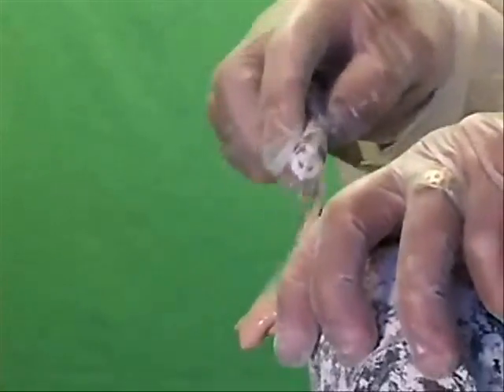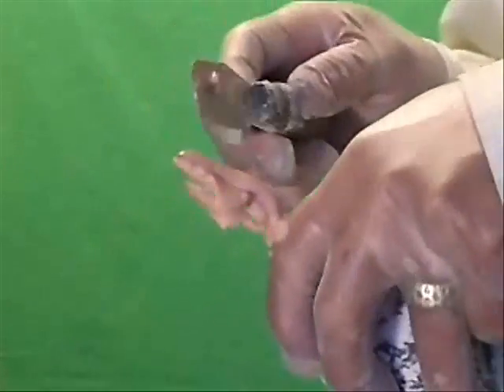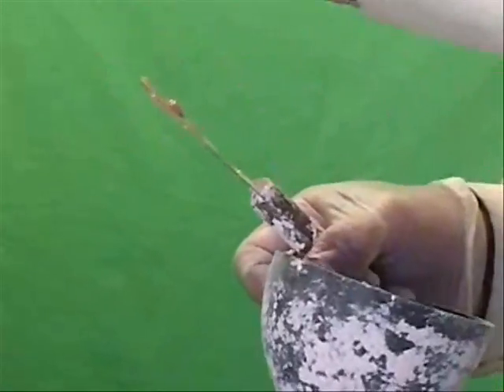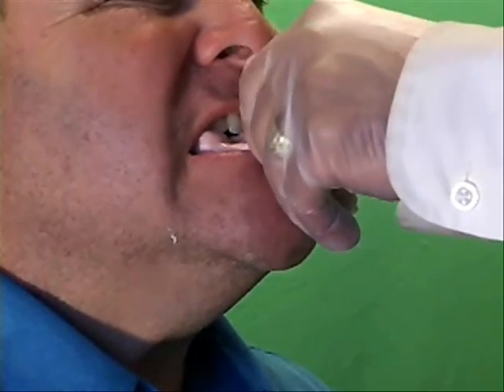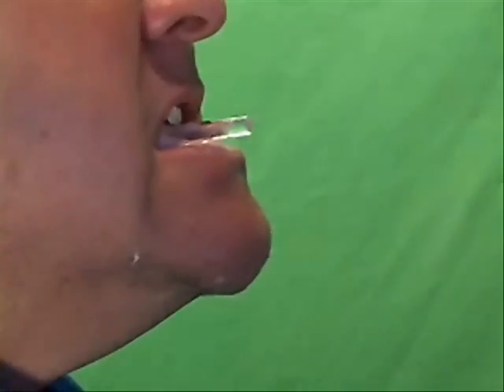Sometimes when you're too far away you can't use it, but this is probably one of the best materials out there. I don't like the blue mousse. It kind of bounces around as you try and use that as a bite material. But here it is. You put it in the mouth, have the patient bite forward. You can slide around. You have a few minutes to play with it. Okay, there. And then it's only biting on a few of the front teeth, which lets the TMJ relax.